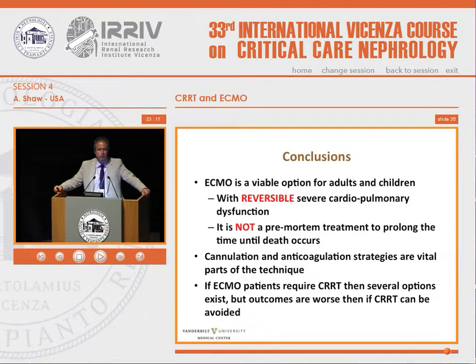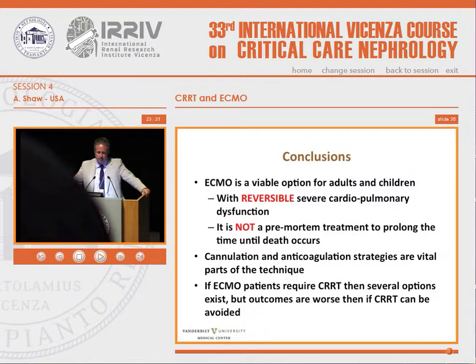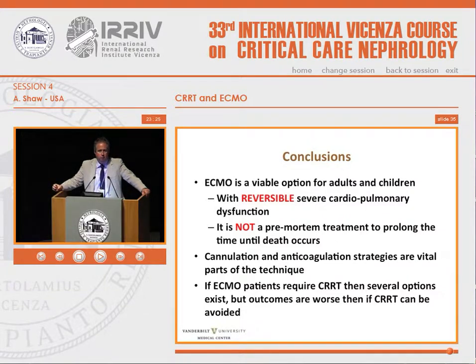It is not a pre-mortem treatment merely to prolong the time until death occurs. That's really, really important. The details really do matter, and I believe that it's all about cannulation. Get that right, and in general, if you get the anticoagulation right too and keep it simple, once the underlying disease process reverses, then the patient should do well.